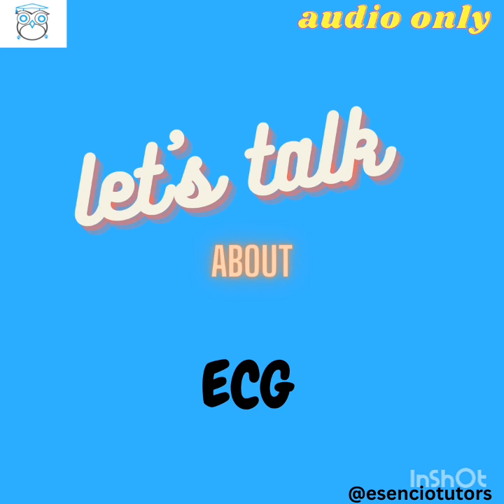If a patient has heart failure, and they're telling you the apical impulse is displaced, they have congestion, the patient has a diffuse hyperdynamic impulse, you're thinking hypertrophy. You hear S3, S4, thinking hypertrophy or dilation of the heart. Then you should know what to be looking for. I'm going to talk about that as well. Tall R waves. All the R waves will be very, very tall, taller than normal because we now have thicker muscles, so the voltage, the height of the complexes, will be up. So you're just going to look for that to confirm it and you move on.